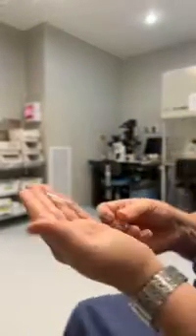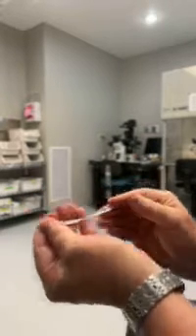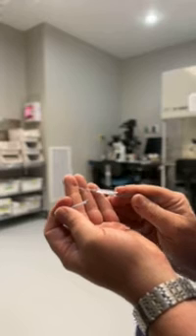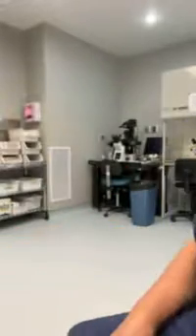And the way they are frozen, they are placed on a little device such as this. This is called a cryo-lock device. It's a little hard to see here, but it's basically a little plastic wand, and one embryo is placed on each one. It's then plunged into a tank of liquid nitrogen and immediately frozen by a process called vitrification.